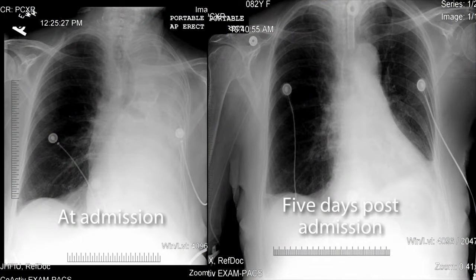The therapists, when they first started using Vapotherm, would complain because for the first 2 days, all they do is suction and suction the patient. Well, it's because these patients would come to us with these big consolidations or old retained secretions, and as we were rehydrating the mucociliary escalator and getting that airway clearance mechanism working again, these secretions started to move out. So that's why the therapists were suctioning so much.